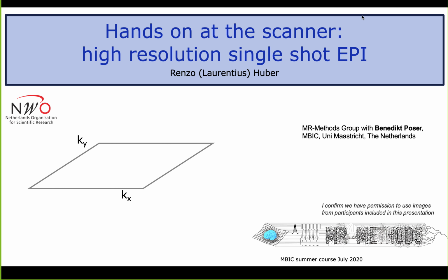Yeah, I think you can see my starting slide. Can you? Okay, Yamin is nodding. So this is focusing exclusively on the topic of the summer course, namely high-resolution functional imaging. And 99.9% of all the high-resolution functional imaging is using a single-shot EPI in the form of 3D EPI or in the form of 2D or SMS EPI. And if it's VASO or BOLD, it's almost always an EPI. So I will focus on EPI.